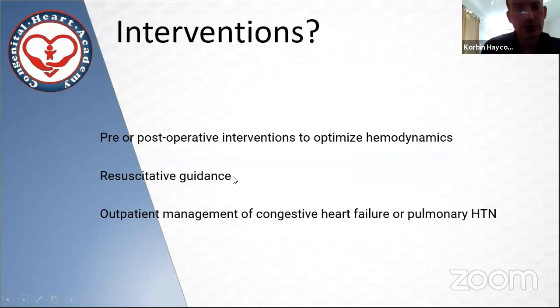And also in things like sepsis, a lot of people are throwing a lot of fluids at these patients, and this can help guide us as to when we've given enough fluids and it's time to go on to another strategy. Also, I know that there's a number of clinicians now using VEXUS in their outpatient heart failure clinics to guide diuretic therapy and to sort out if it is congestive renal injury or a cardiorenal situation going on, or if there is an overdiuresis happening.